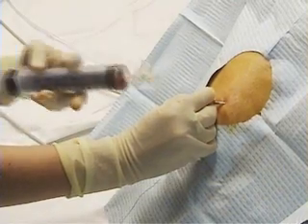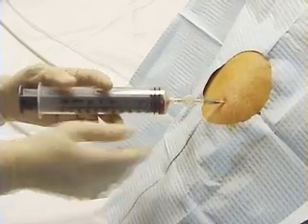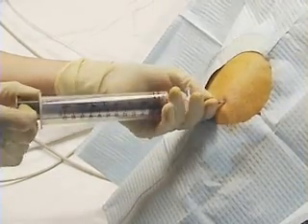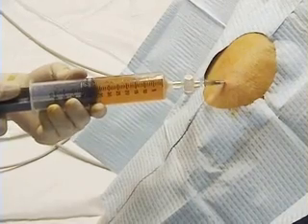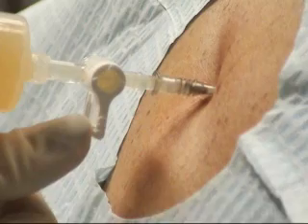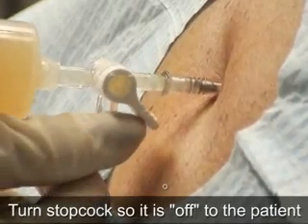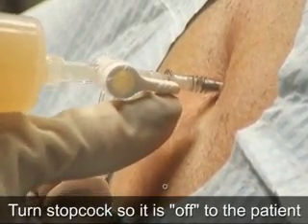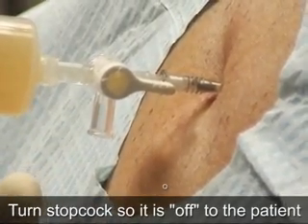Next, attach the three-way stopcock and large syringe to the catheter and continue to aspirate fluid. When the syringe is full, adjust the stopcock so that it is closed to the patient. The stopcock should be opened to the patient only when fluid is being actively drained.